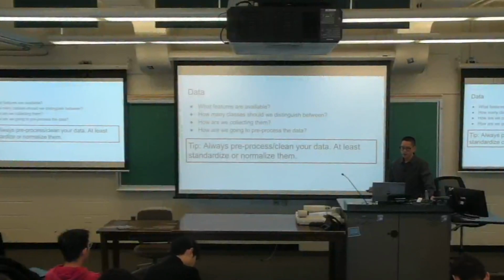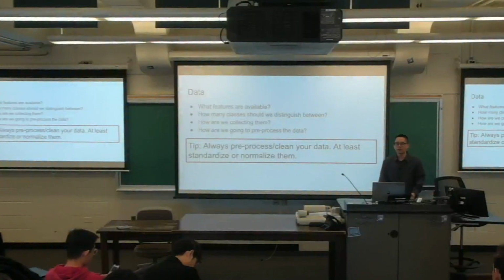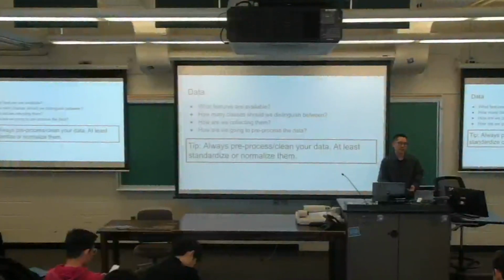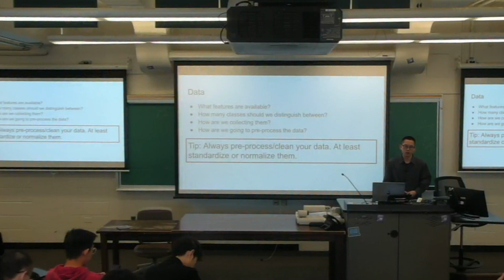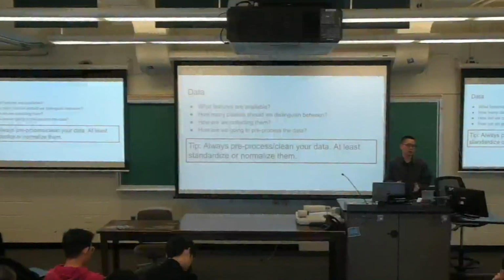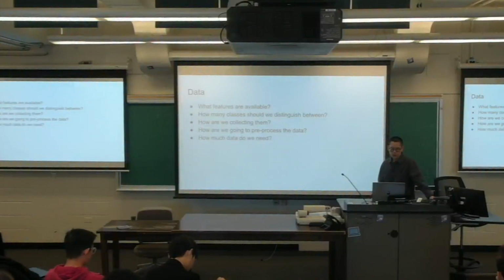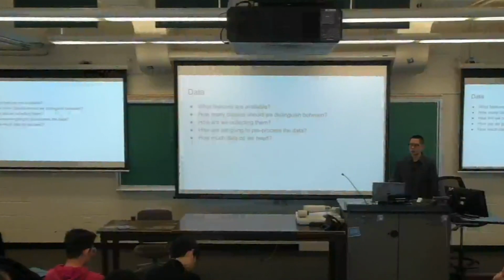Okay, and this is important. So for our application, we have 8-channel EMG signals. Each feature is a channel of EMG signals. They don't follow a different scale, but we still do standardization because the algorithm will have an easier job if it sees small floating numbers in a good range, 0 to 1, compared to an integer that goes up to 1500. So we do standardization, and the question next is how much data do we need to solve the problem?